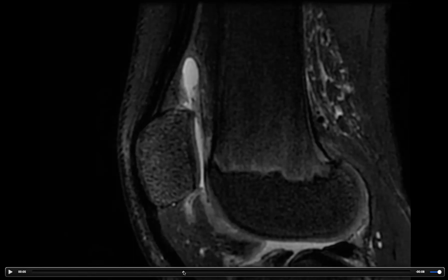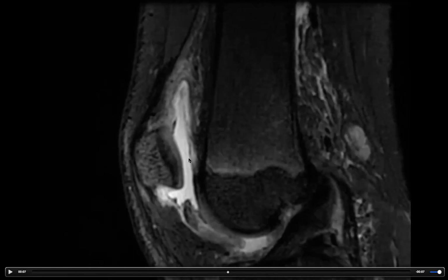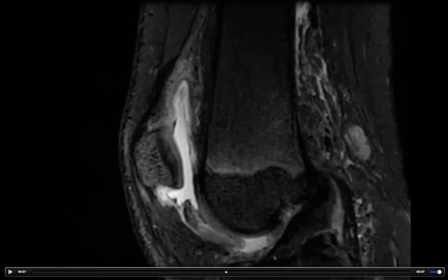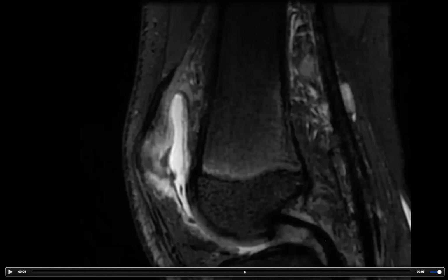One of the main findings here is that there's just too much fluid. If you look here, there's all this fluid, and this is abnormal. Usually you don't have that much fluid in a joint like this. So it's what's called a joint effusion. And just as a nice example, this is an ACL, anterior cruciate ligament. Folks have probably heard of this from ski injuries, right? That's the anterior cruciate. This is the posterior cruciate ligament here.